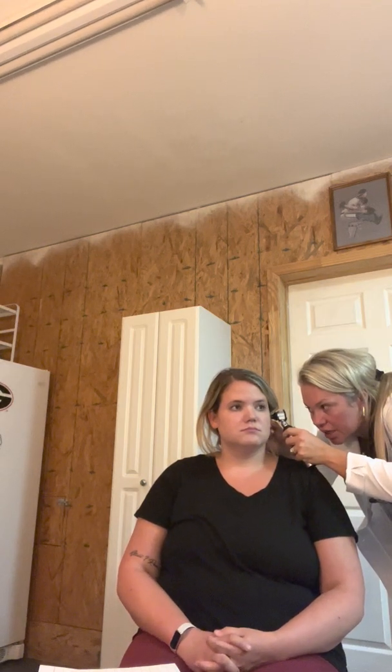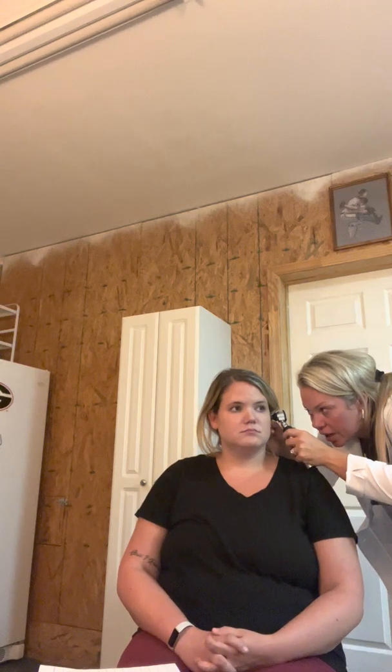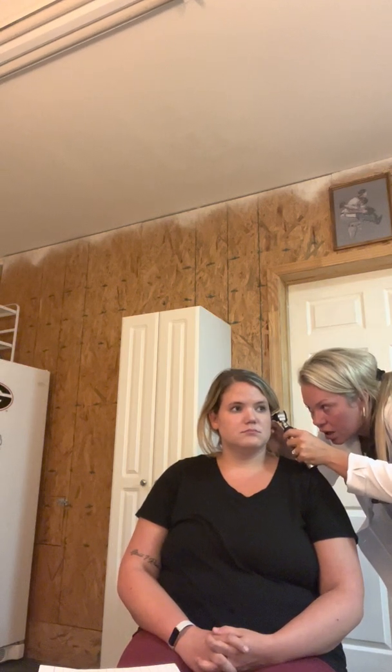This is your left ear. The cone of light is located at 7 o'clock. The tympanic membrane is moving in and out.